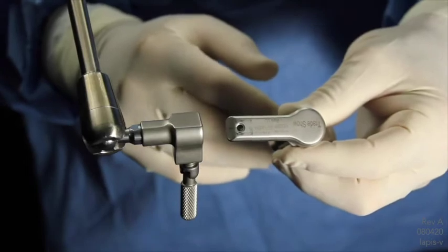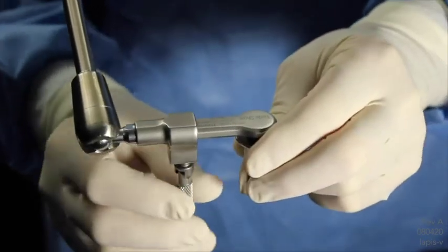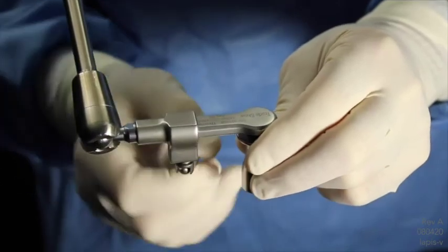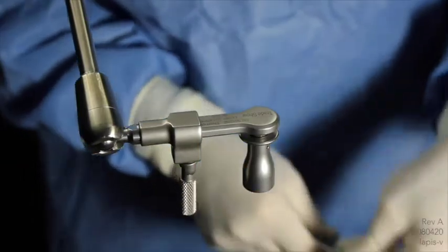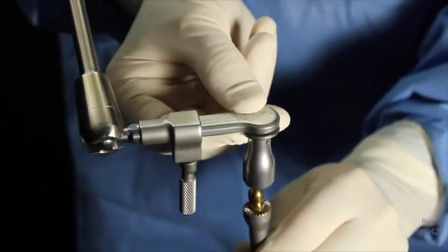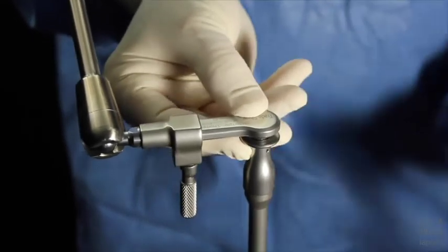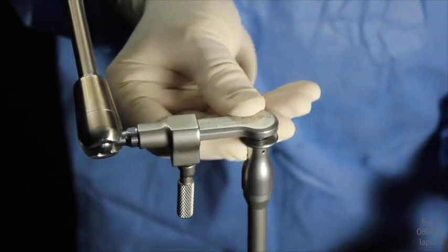The S-Lock Nathanson hook functions by simply inserting the adapter into the head of the articulating arm and tighten. Then, insert your Nathanson hook into the adapter and lock it into its desired position.